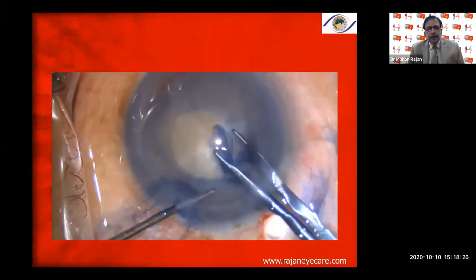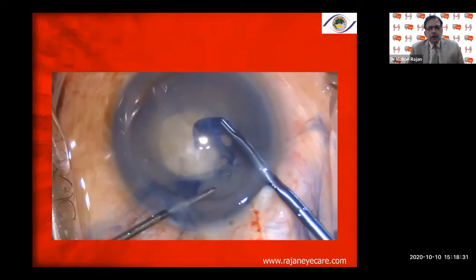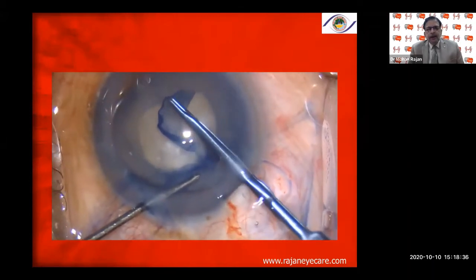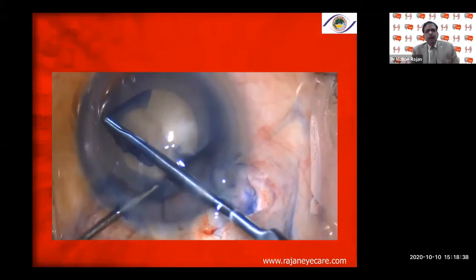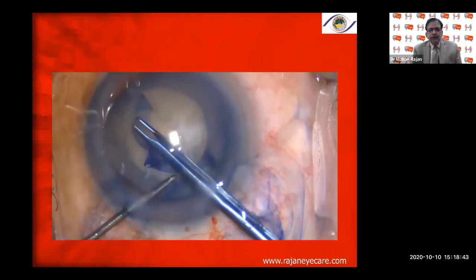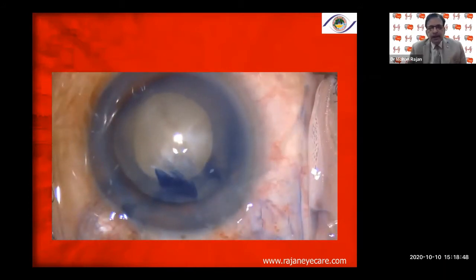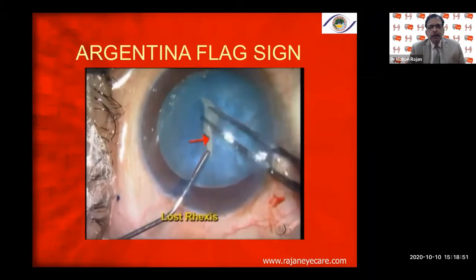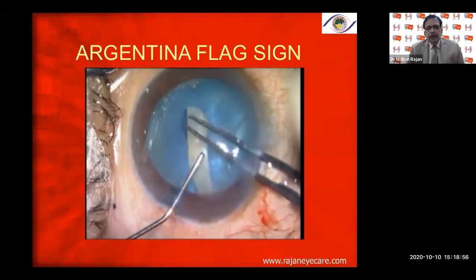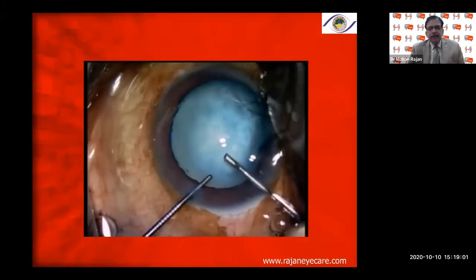The movement of the instrument must always be towards the center of the pupil — centripetal — concluding the tear from outside in. You have to keep on registering this in your mind repeatedly; when doing the capsulorhexis, it has to become secondary or even tertiary nature for you, because this is the most important step in phacoemulsification in my opinion.